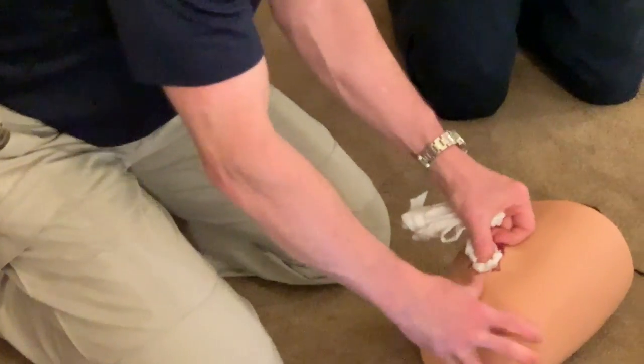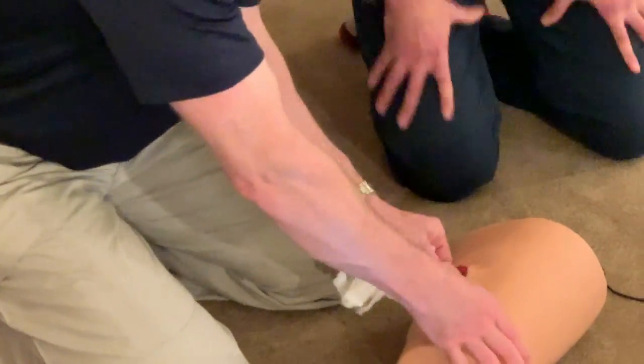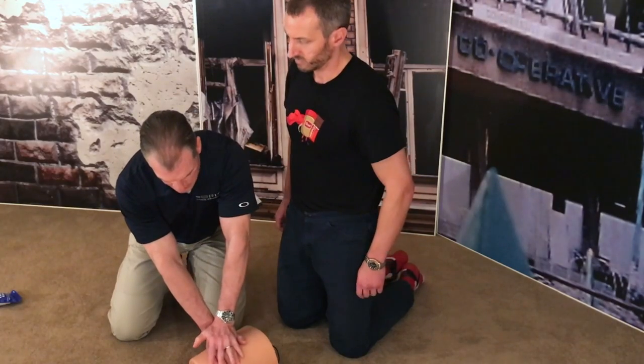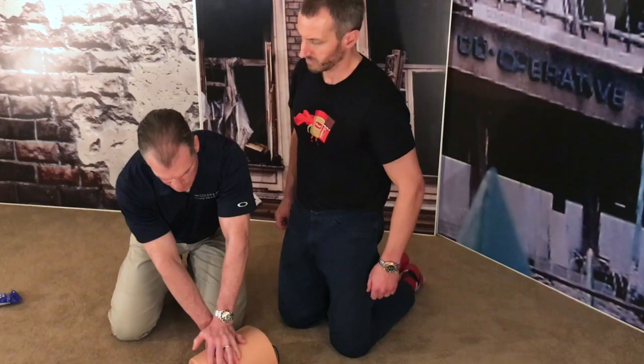Next step: the wound is all full, and we're going to pull the wound edges apart to get that gauze underneath and create even more pressure. Then last — Mike didn't show this now, but we'll see it later — he takes the rest of the gauze and pushes it on top to keep direct pressure. You've got to do that for at least two minutes for the combat gauze hemostatic agent to really take effect. Once it's fully packed, take whatever gauze is left over, maybe another roll of CurlX, and do two-handed pressure for two to three minutes.